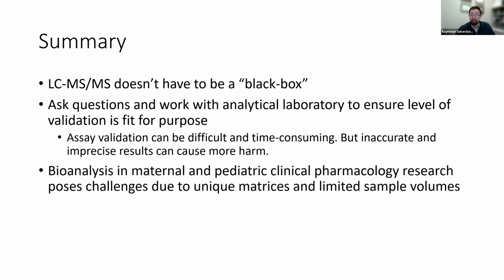So bioanalysis in maternal and pediatric clinical pharmacology research poses a lot of challenges. The unique matrices are in themselves a challenge, but as I mentioned earlier, and Jeremiah mentioned earlier, there are the sample volumes. For instance, if you're doing a neonate plasma study, you don't get a lot of plasma from them because they have high hematocrits, and even if you're not doing a heel stick, the microcontainers typically hold only somewhere between 200 microliters and a milliliter. So that's something to keep in mind.